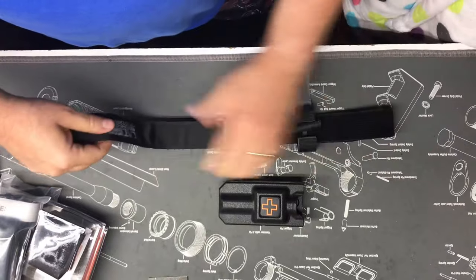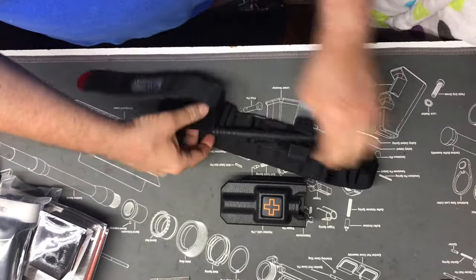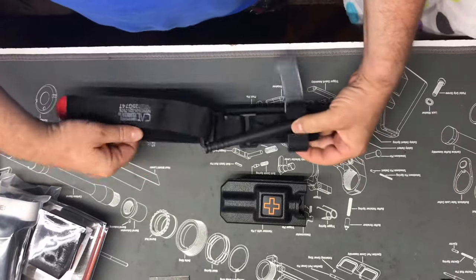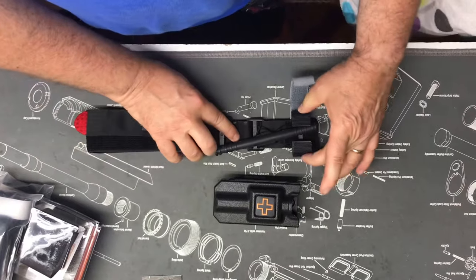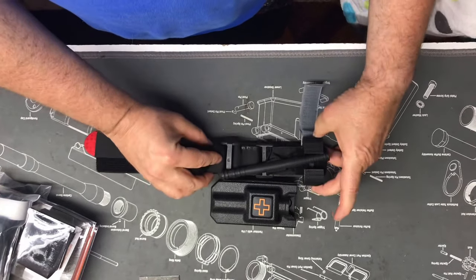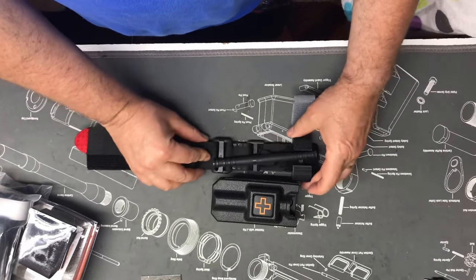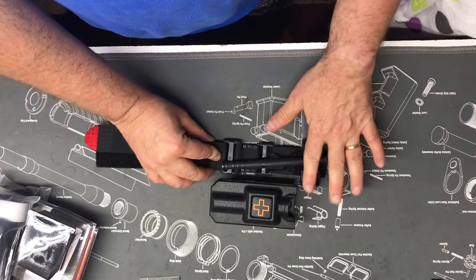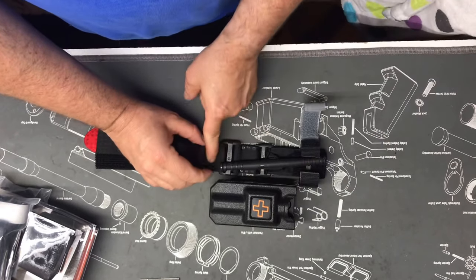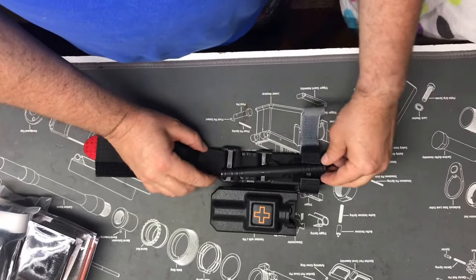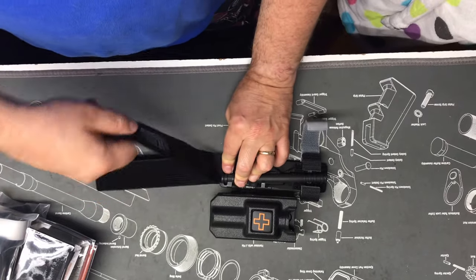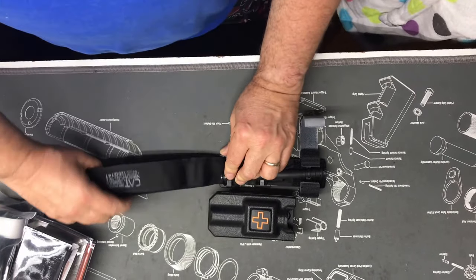First thing that I do is I've got a measure. The way I measure it is because this part of the CAT tourniquet actually sticks out of the case, I measure it from the top of the case right there to right about the bottom of the buckle.